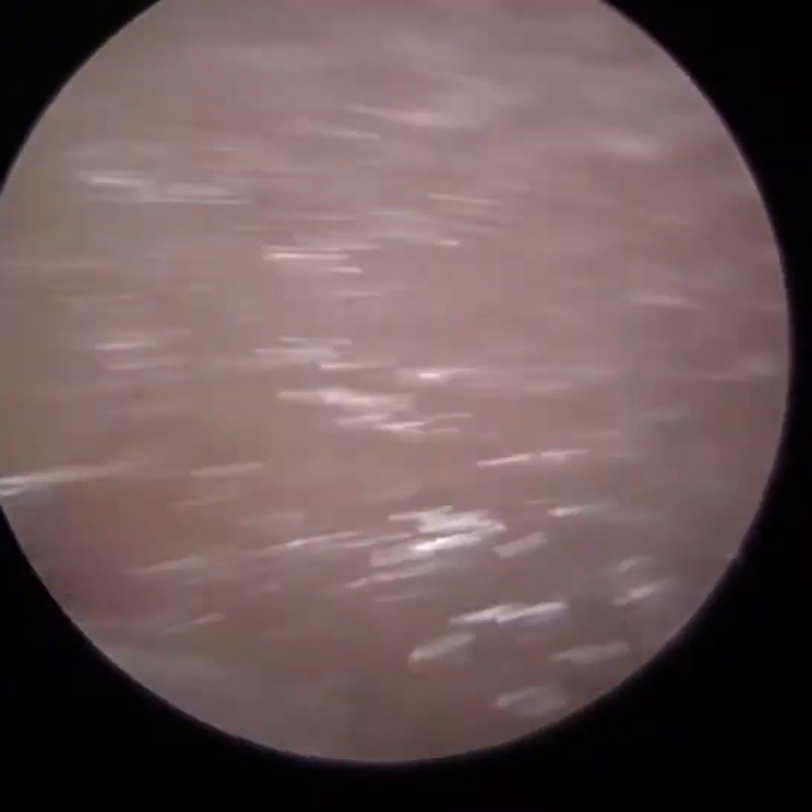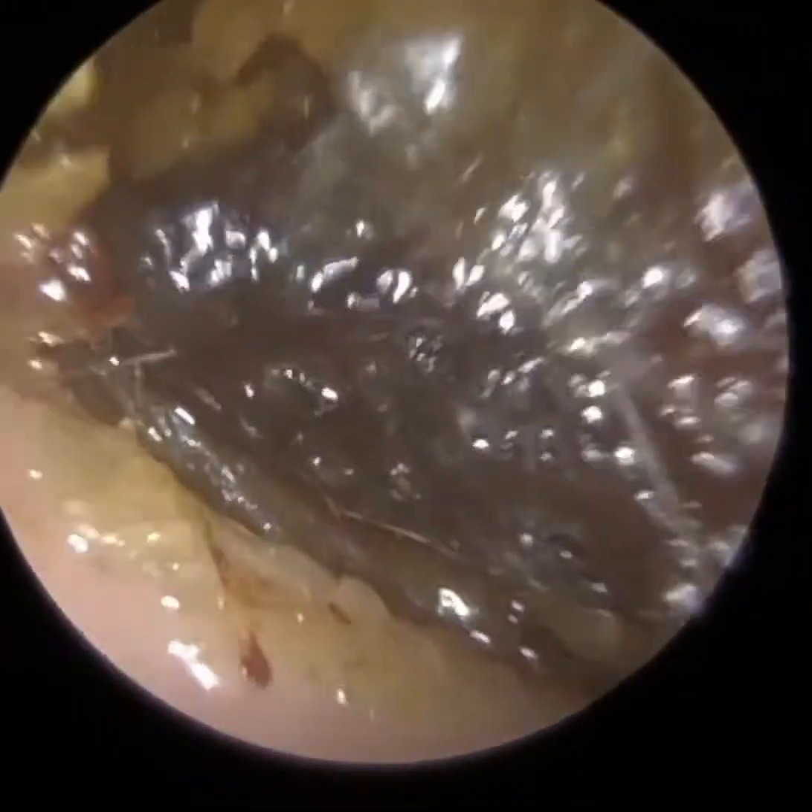Thank you for joining me in my latest demonstration video of our recently developed Waxscope. The pre-procedure video was taken with the iClearScope Endoscope, and now for the procedure I'm using our Waxscope.